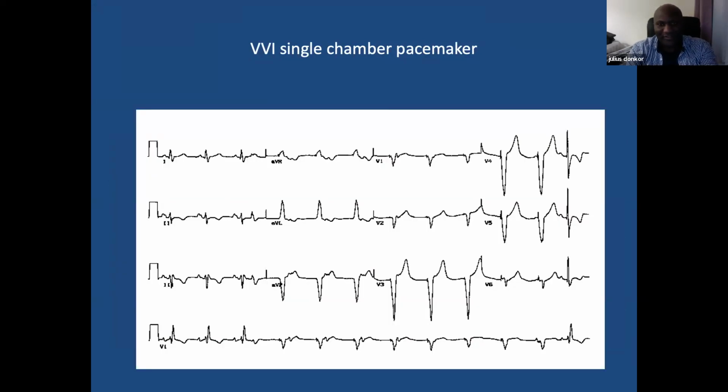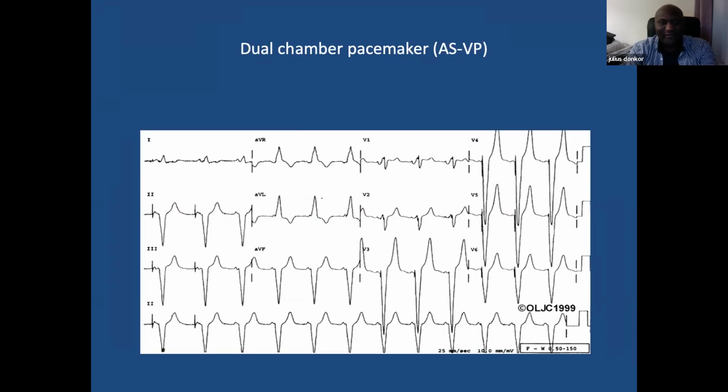Single chamber ventricular pacing there, dual chamber.